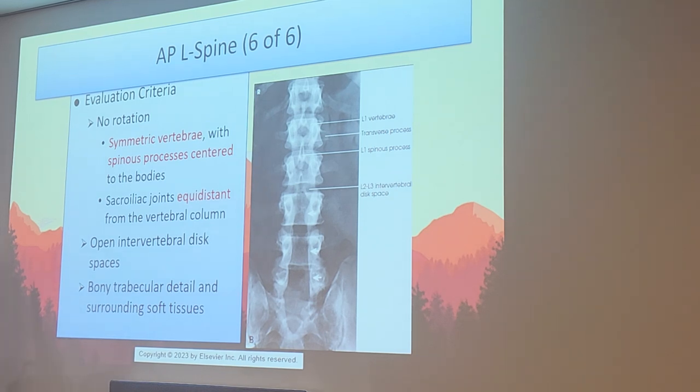This is a good question. You're not supposed to do that. Keep that in mind, because they want to measure how bad the scoliosis is. They have to see how it's curving. That'd be like, I have a fracture that opened up the bone, so I'm going to angle it and close it back up. So you wouldn't want to do that, because that's going to defeat the purpose of seeing the pathology, right? Makes sense.